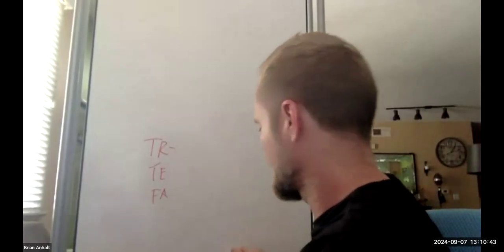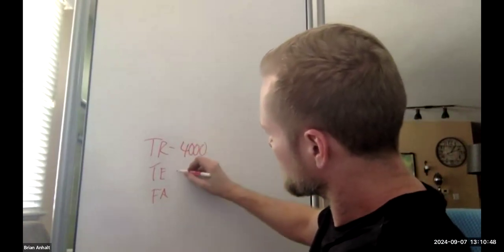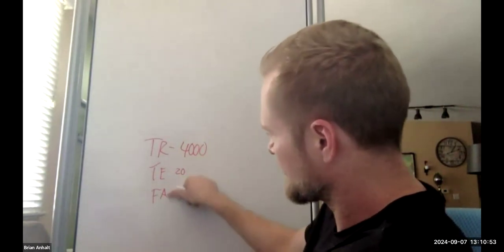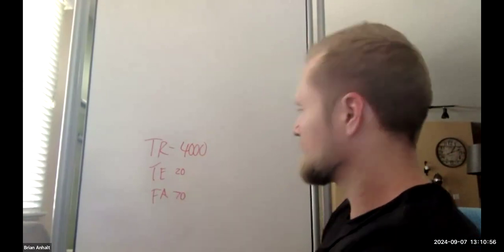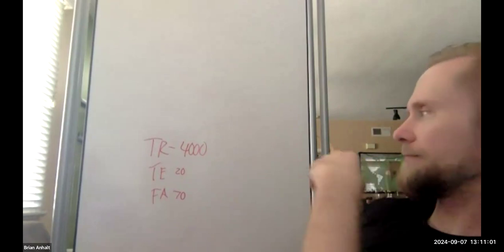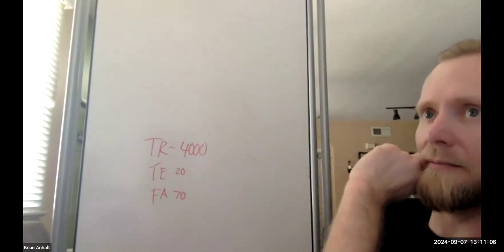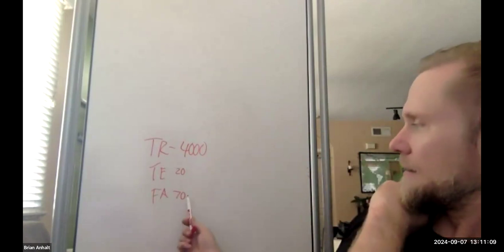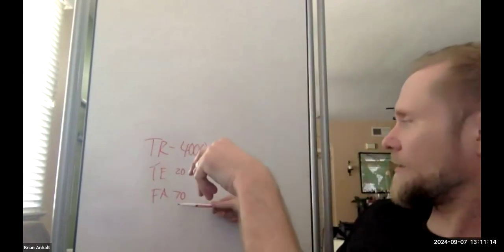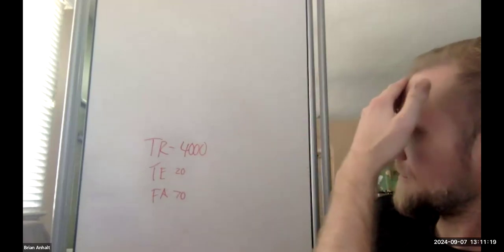There's no reason to have a TR like that if this is a gradient echo sequence. We're going to allow for full longitudinal recovery with a higher flip angle anyway, so there'd be no reason to lower the flip angle at all.